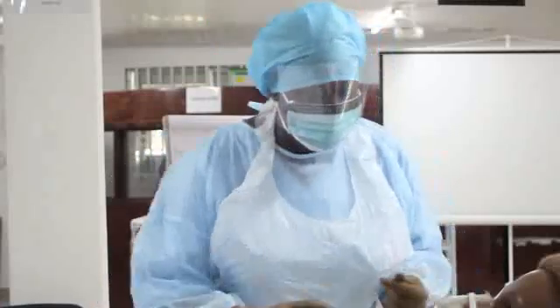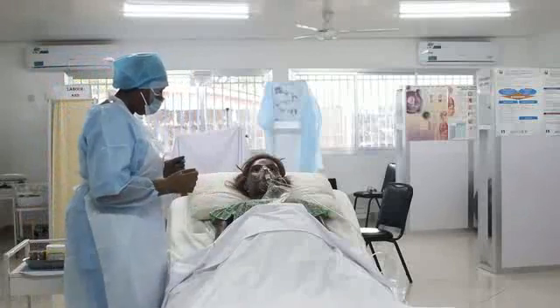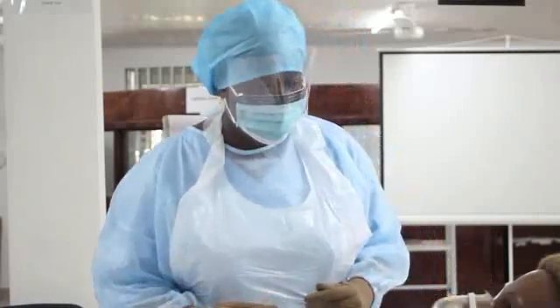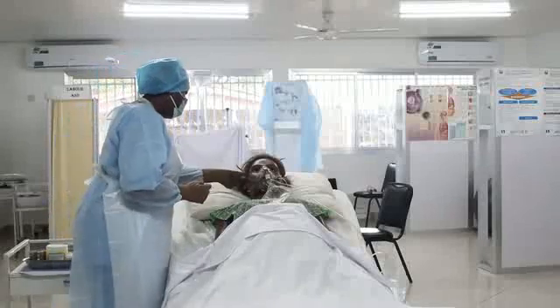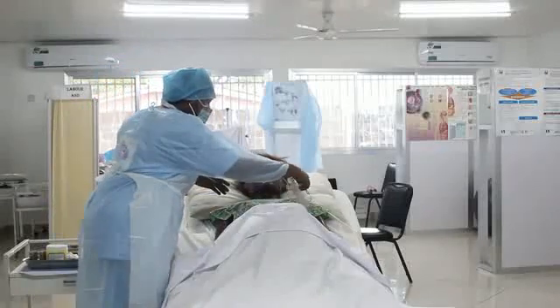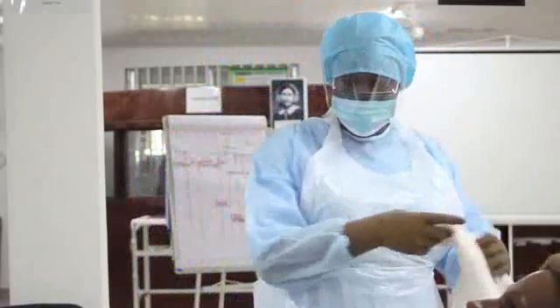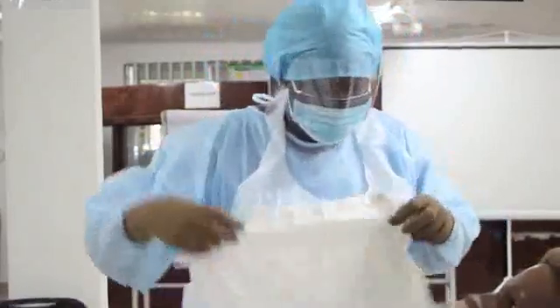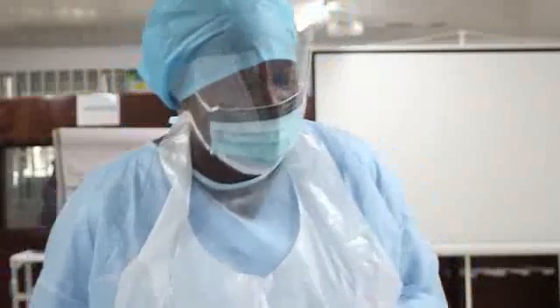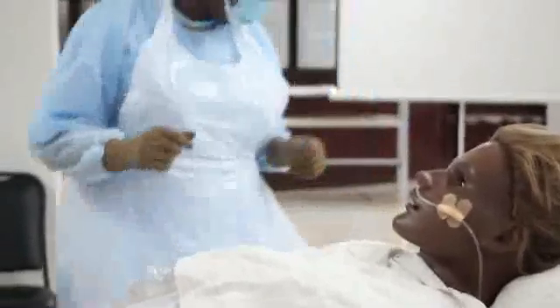So I am going to first of all remove your oxygen mask. If during the procedure or at any time you feel you are distressed and you need your oxygen mask, can you please tell me? And I'll be most willing to fix your mask again, okay? So I'm going to take your mask out, and I'm going to put it right here closer by you, just in case you need help. So I am going to apply the towel to prevent your clothing and your chest wall from soiling. Jessica, do you have any question to ask before I continue with this procedure? You're fine. Okay, thank you.